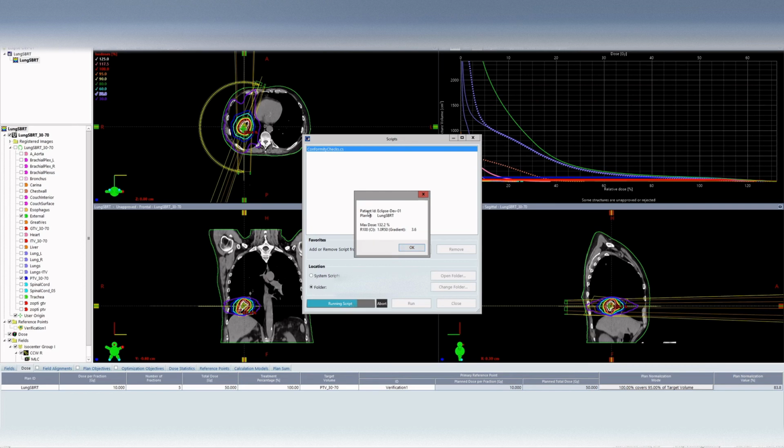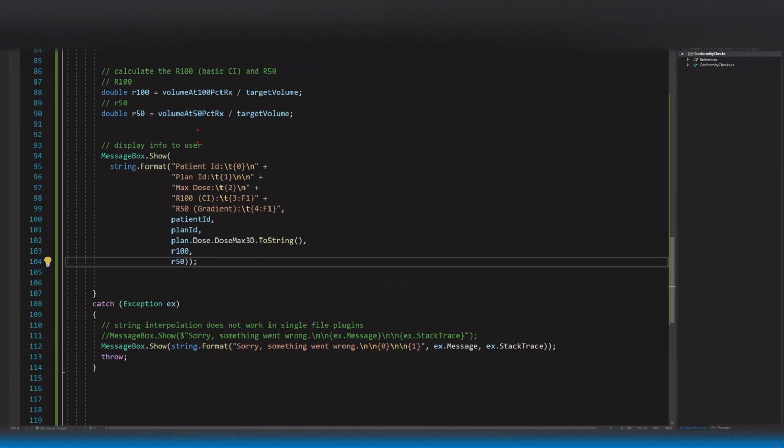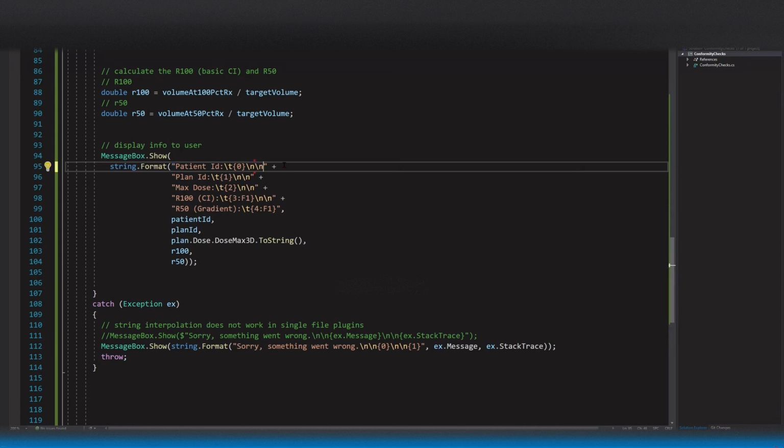I'm sorry. Okay, so patient ID. So then we have this test patient's ID, and then plan ID, right? It's over here, LungSBRT. And then we have a max dose of 132.2%. And then we have the R100. Oh, so we can see there's not a new line after the R100. So let's go to our code, and you've probably been yelling at me to add that. Silly me. Okay, so let's do that, and actually let's add a little bit more space after the max, and let's go ahead and add a new line. That way it just has a little more space in between each thing. Makes it a little easier to see, and it might be easier for you to see too.